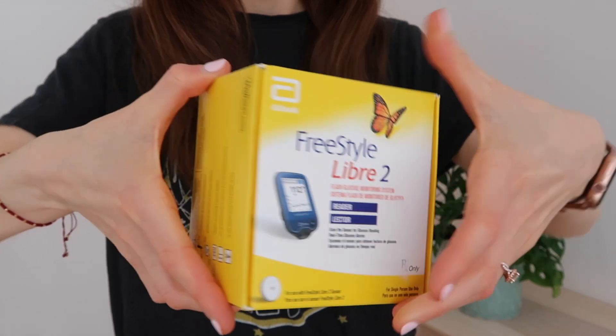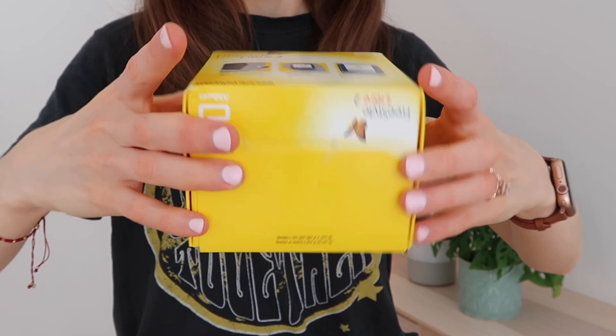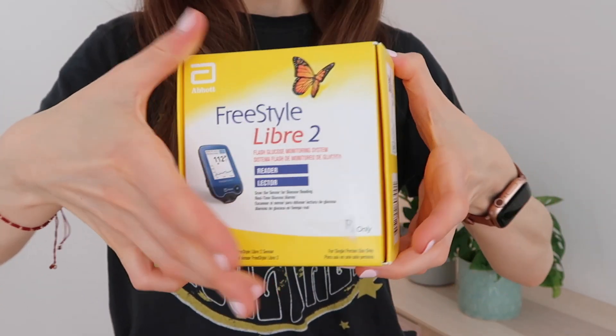First up, we have got the box — one box which includes a reader and I believe a sensor. Full disclosure: my first Freestyle Libre that I reviewed, I bought myself in the UK where I live. This one I applied online when I was in the States for a free prescription, got it through, took it to my doctor and he prescribed it. So I didn't actually have to pay anything for this device and I'm not working with Abbott. All reviews and opinions are my own — very important to state in this video.